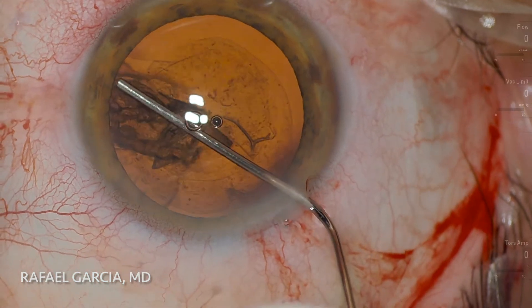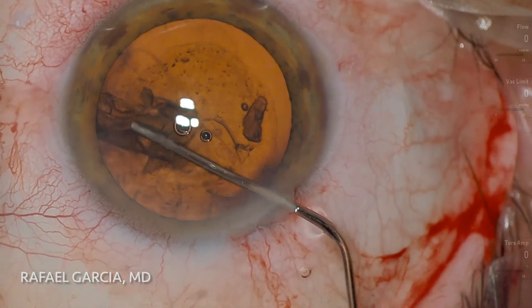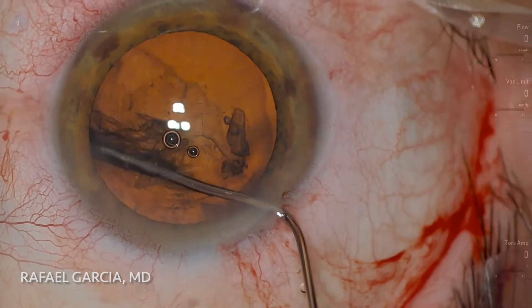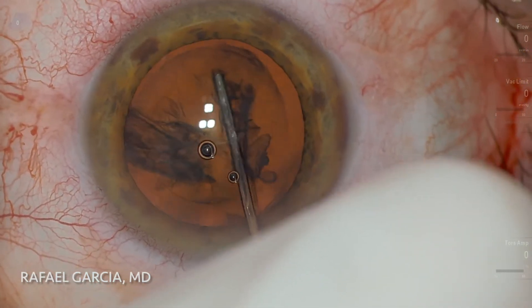Since it's a soft cataract, we like to do some hydrodissection and also some hydrodelineation. As the BSS is injected with the blunt cannula, we are able to see some nice fluid waves going around the nucleus.